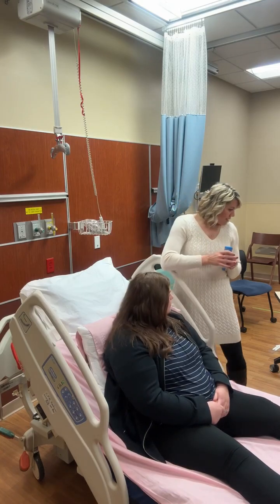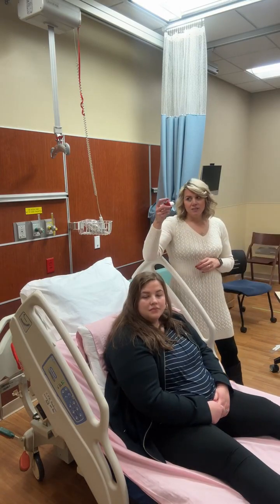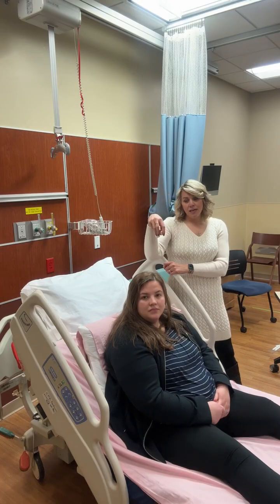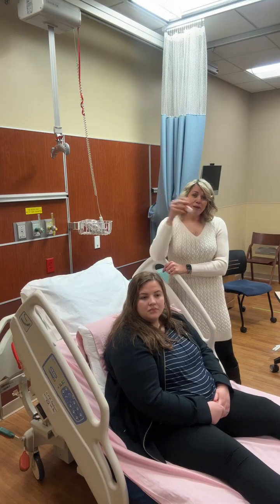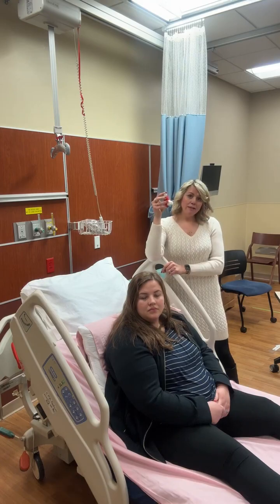So that is typically how you're going to use an inhaler. This is the boot style, and a lot of medications, a lot of inhalers come like this. You need to know your class of medication. In SimLab, the patient is always going to ask, what is this medication? What does it do? How fast is it going to work? You can always expect in SimLab us to ask you that for every medication that you give, especially respiratory medications. So just keep that in mind.